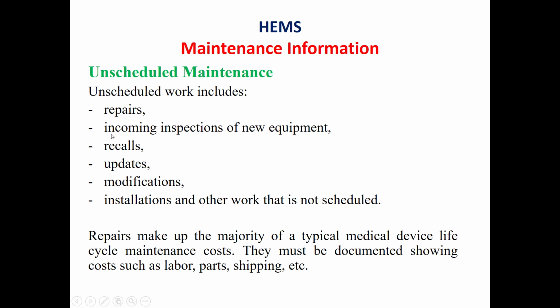Repairs will be the majority of the typical medical device life cycle maintenance cost.